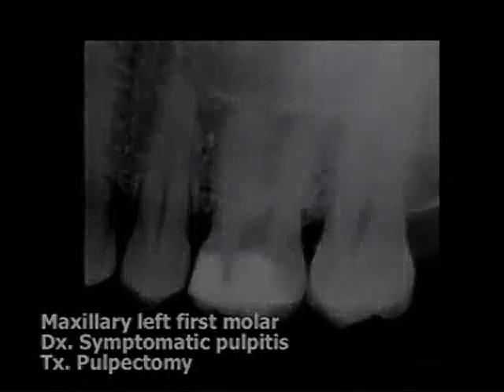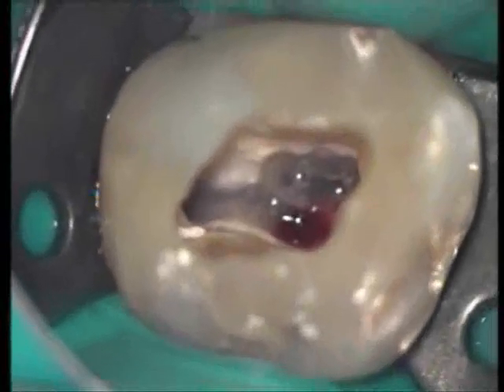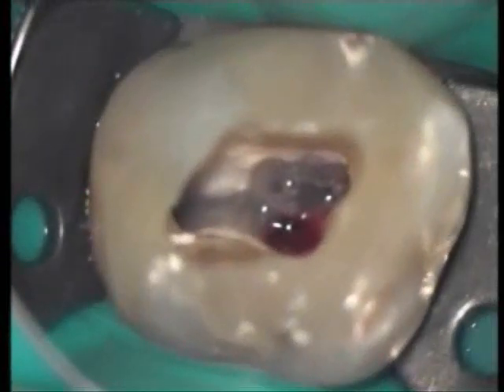The patient is anesthetized and we have prepared the access cavity, removed the coronal pulp, and located the four root canal orifices. A rubber dam has been applied and the field of operation is disinfected.